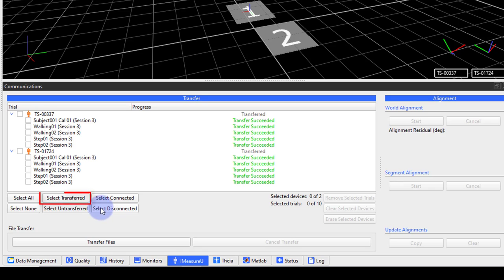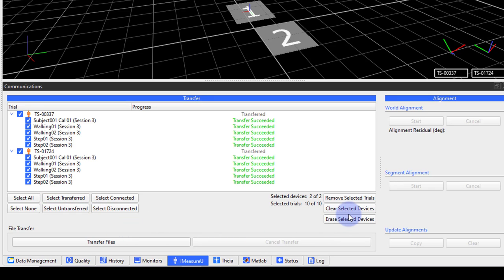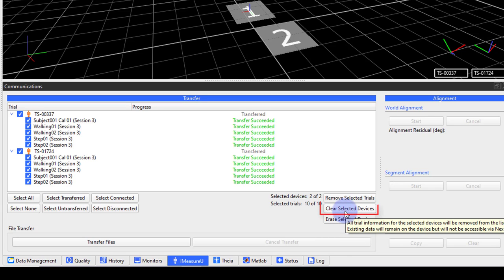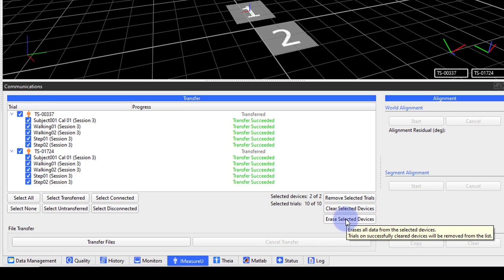Once the transfer is complete, I'll click select transferred, then I can either clear devices or erase devices. Clearing devices will remove the trials from the transfer list. However, the data will still remain on the sensor.